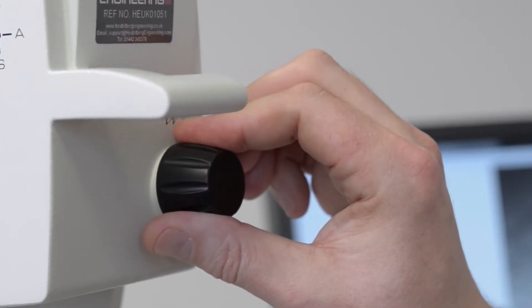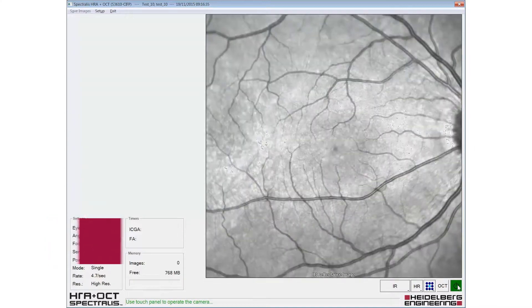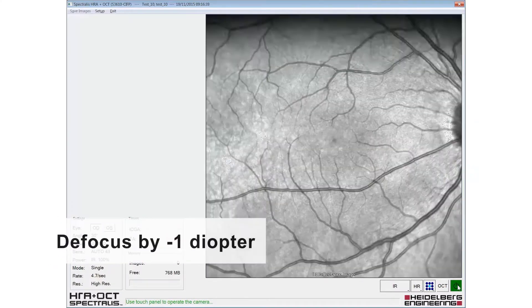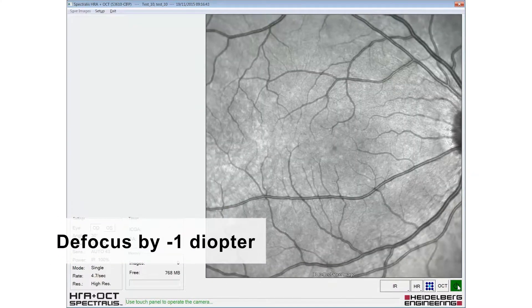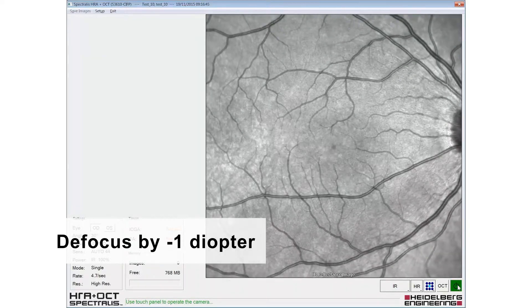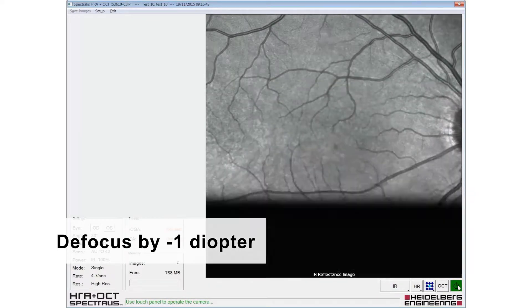The image should be adjusted for sharp focus in the infrared mode, and then a minus one dial up to defocus applied before selecting BluePeak autofluorescence.